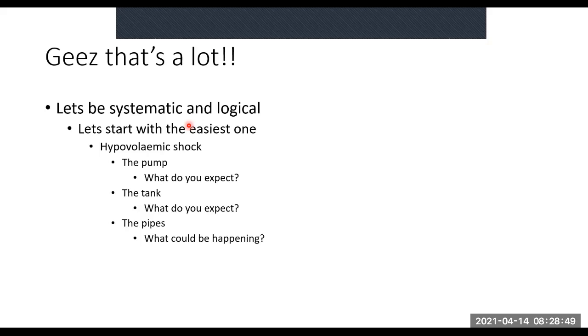All right. And what do you expect to see in the vessels? Do you expect to see them full of fluid, or do you expect to see them empty? Empty. Can you check every vein in the body? So which is the most common one that we check on ultrasound? Okay, I'll give you a clue. It runs inferior, and it's known as a vena cava. So it's the inferior vena cava.